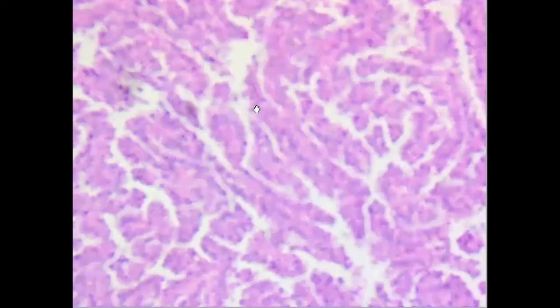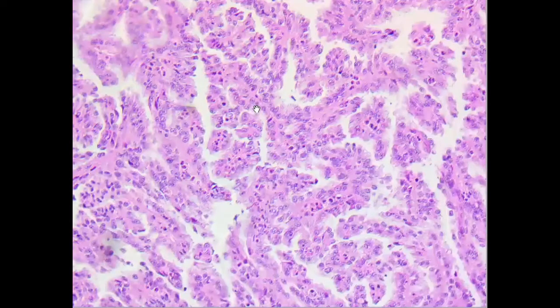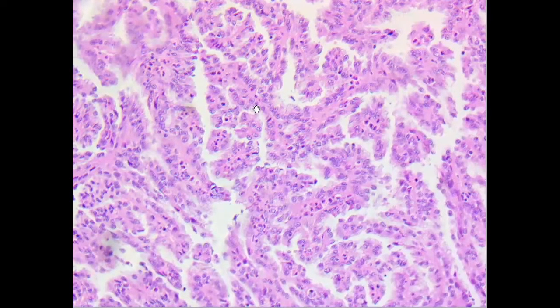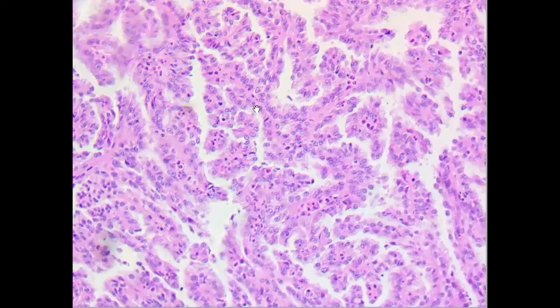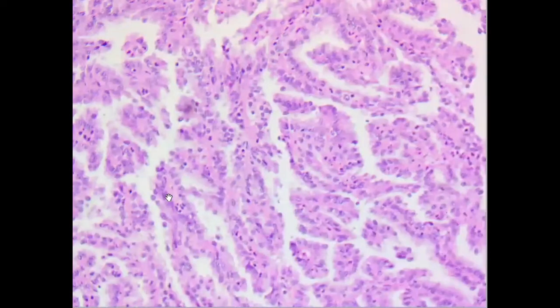Let's go on a higher magnification. So yeah, this is more clear at this magnification. You can see the cores, and you can see the malignant cells surrounding them. I hope you can appreciate also the nuclear features. The cytoplasm is a bit eosinophilic, and you have these nuclei with a prominent nucleolus inside each of these cells. We might go to a higher power also to appreciate more features of the nucleus.